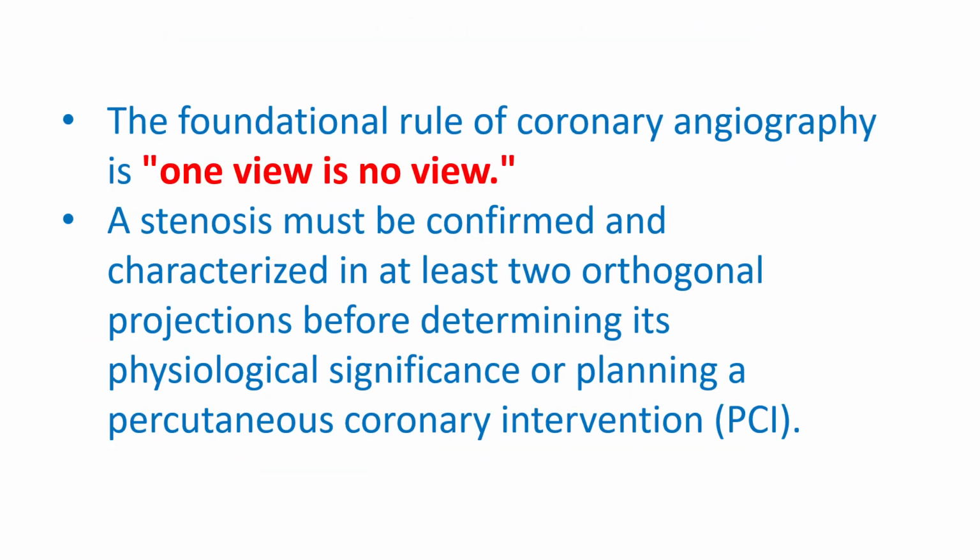The foundational rule of coronary angiography is: one view is no view. A stenosis must be confirmed and characterized in at least two orthogonal projections before determining its physiological significance or planning a percutaneous coronary intervention.